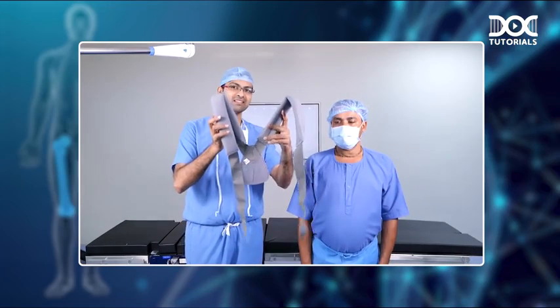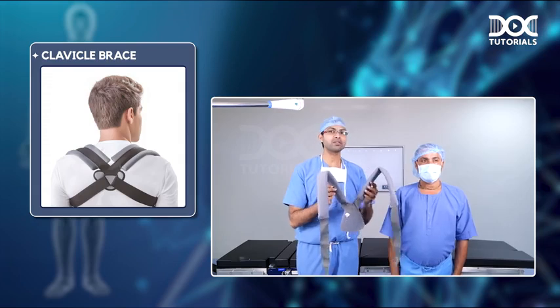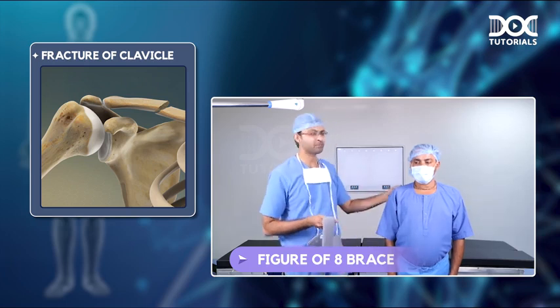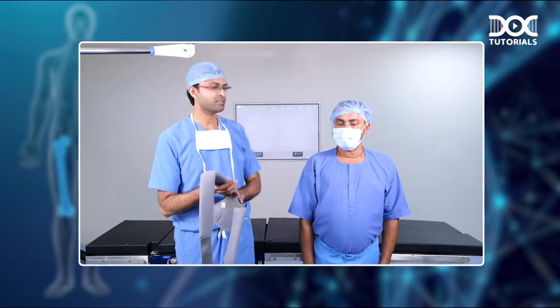Now what brace is this? This is the clavicle brace, which is also called figure of 8 brace, which is used in which condition? Fractures of the clavicle, isn't it? So imagine that my friend here has a clavicle fracture. So how do you apply this clavicle brace?